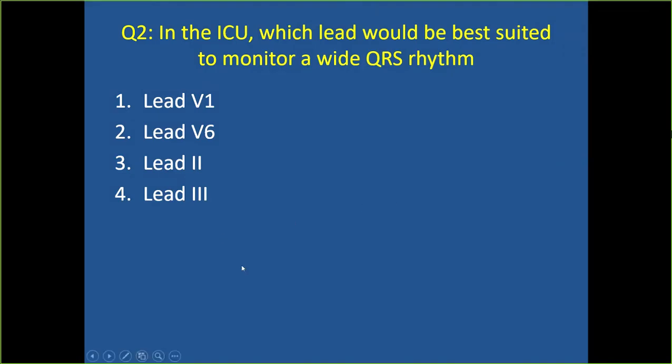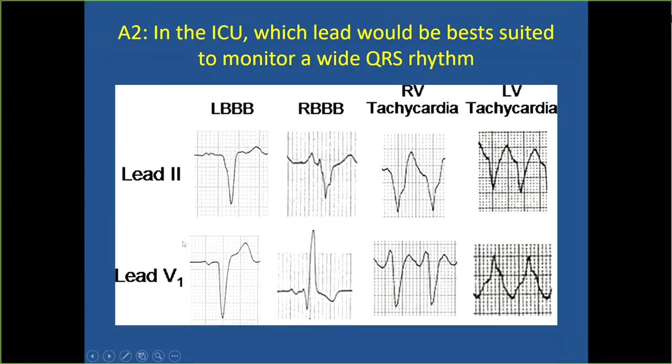By habit, we have it, like always lead 2 is the default lead on monitor. So what is the result? Maximum are with lead V1. That's fantastic. V1 is to be followed. Next slide. Can you see the slide? So this is the reason why V1 should be followed.